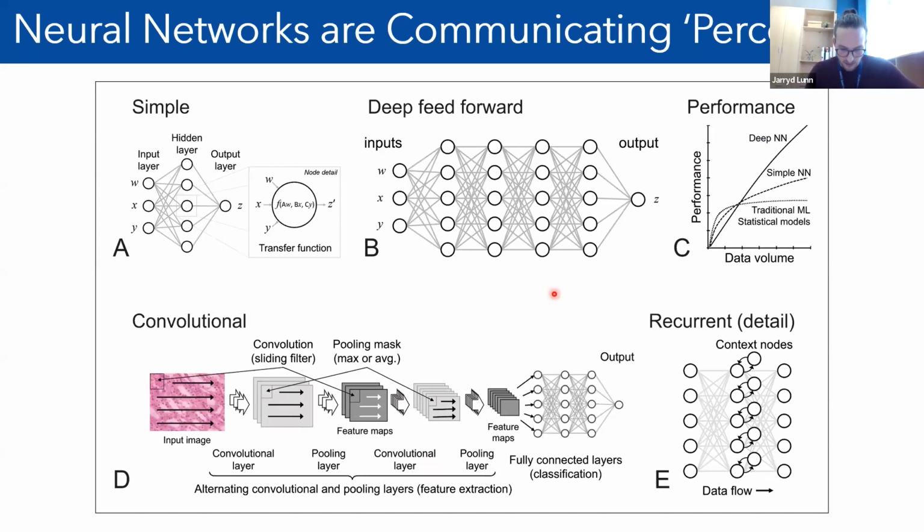Convolutional networks are something that are seen a lot in cytopathology research and the things that I've read. It's a means of image processing that extracts features through several initial convolution and pooling mechanisms, and that are then fed through into a network in order to generate an outcome.